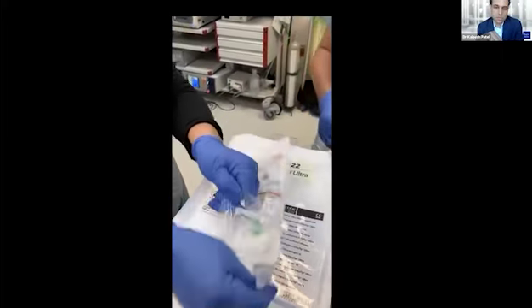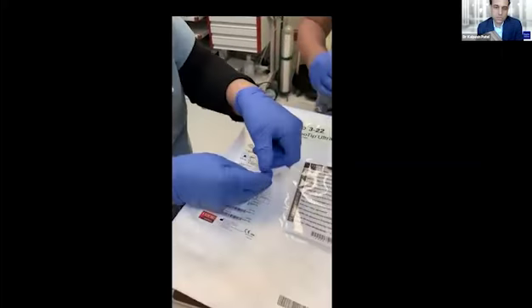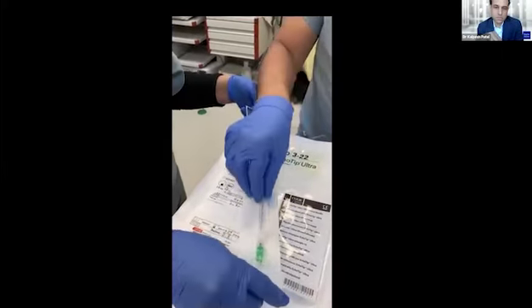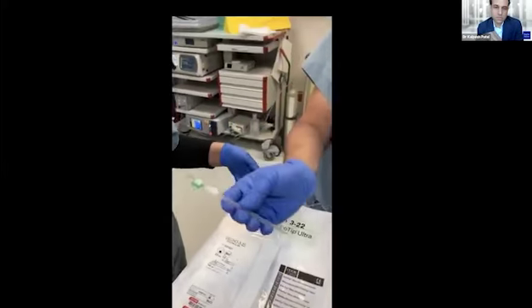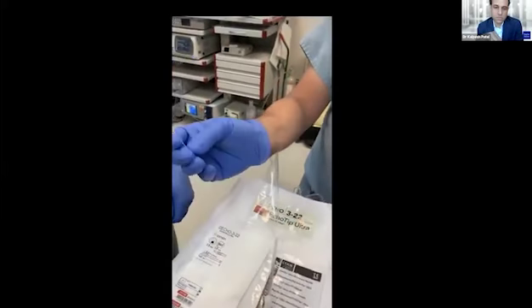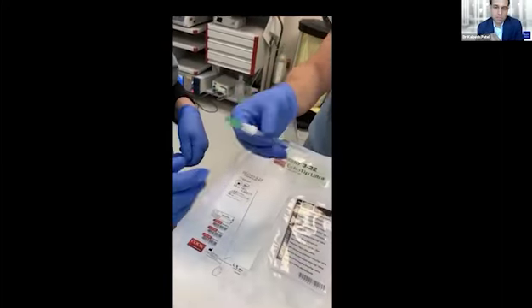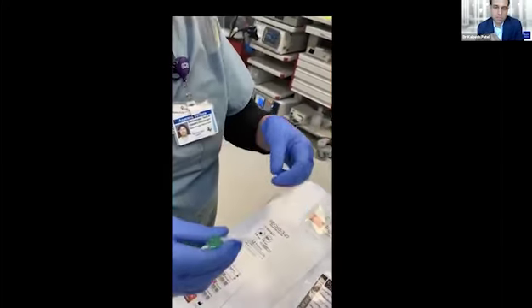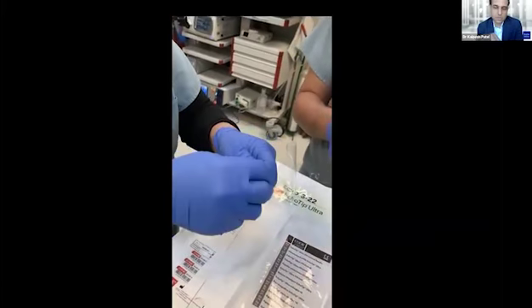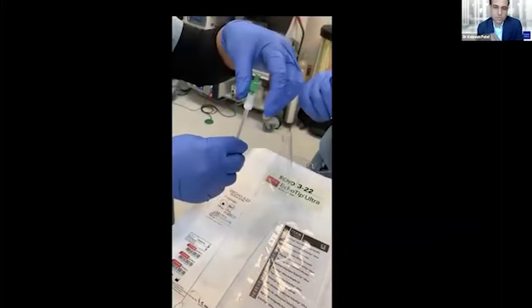Now it comes in 2 layers of packaging. It's important to note the contents of the package. So initially we'll have the coil, which is contained within this sheath catheter. And separately, there'll be a plunger with a round top. So you want to make sure you don't lose that. Susie's going to demonstrate how to take the safety wire out of the coil. Correct. Very good. Now the outer sheath is removed while holding the white.